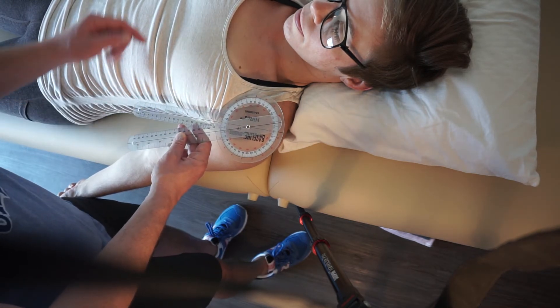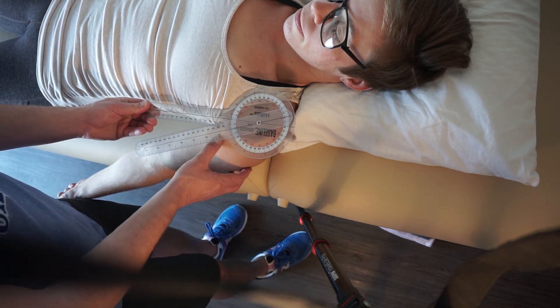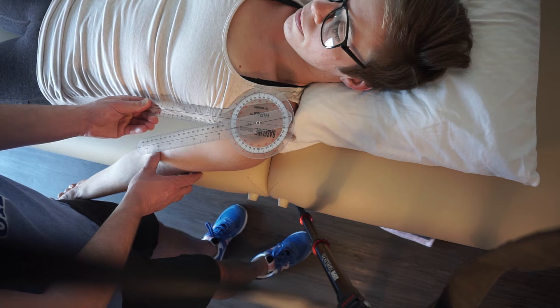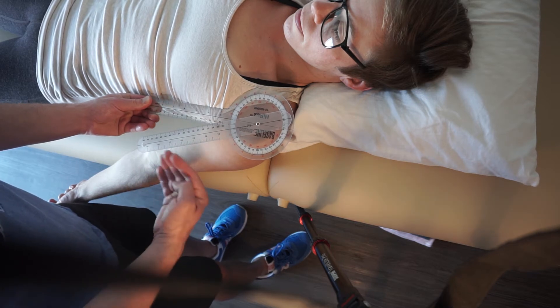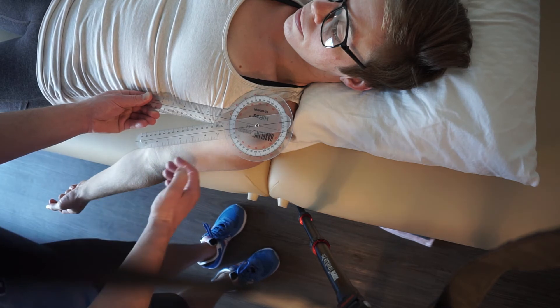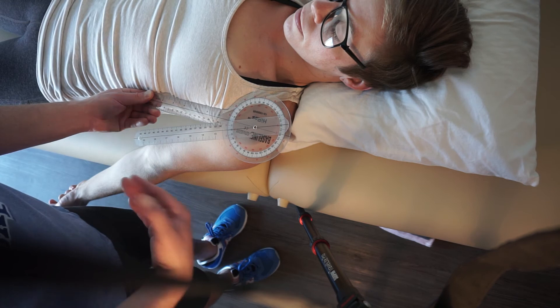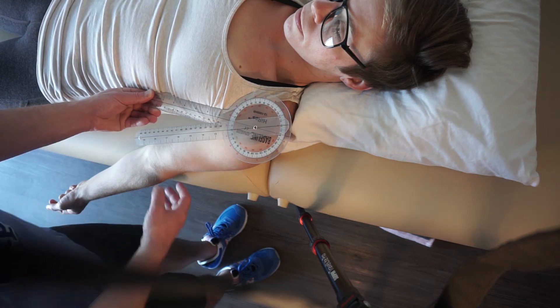The stationary arm is going to go parallel with the sternum, and you want the patient externally rotated in the anatomical position, then bisect the humerus for the moving arm. I generally stand in a position so I can get out of the way as soon as she starts to abduct — that way I'm between her body and the arm and have more control.